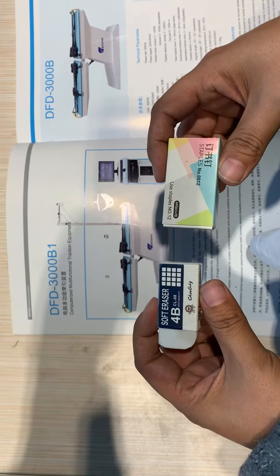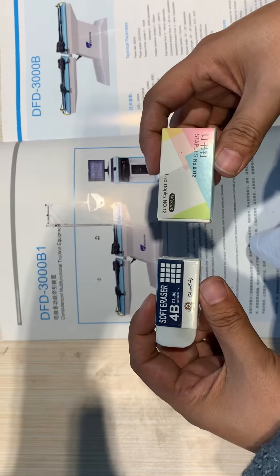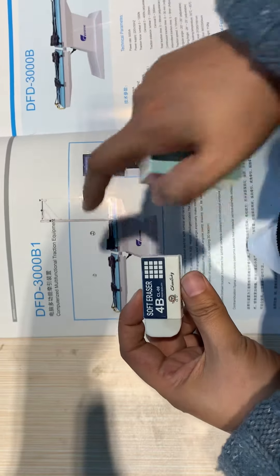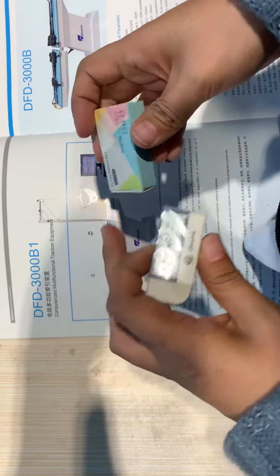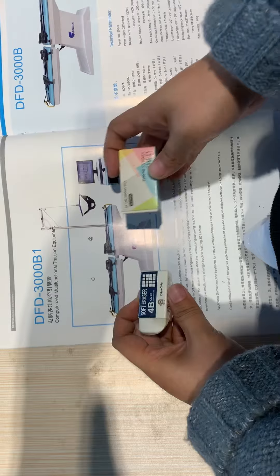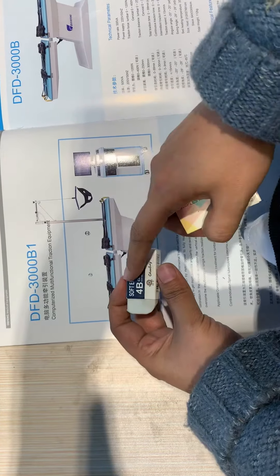This is for medical use. I will introduce you to the functions of the DFD-3000B1 traction table. This part is Part 1 and this is Part 2. Part 2 is fixed, so I will just show you the functions of Part 1.